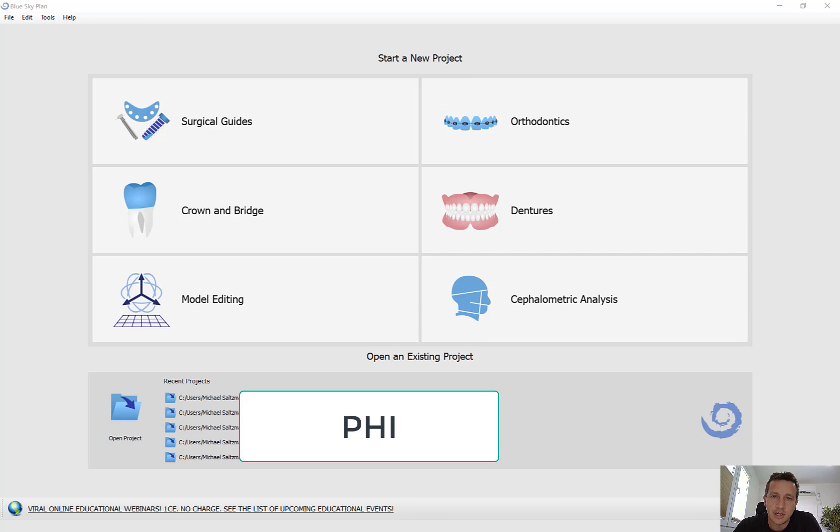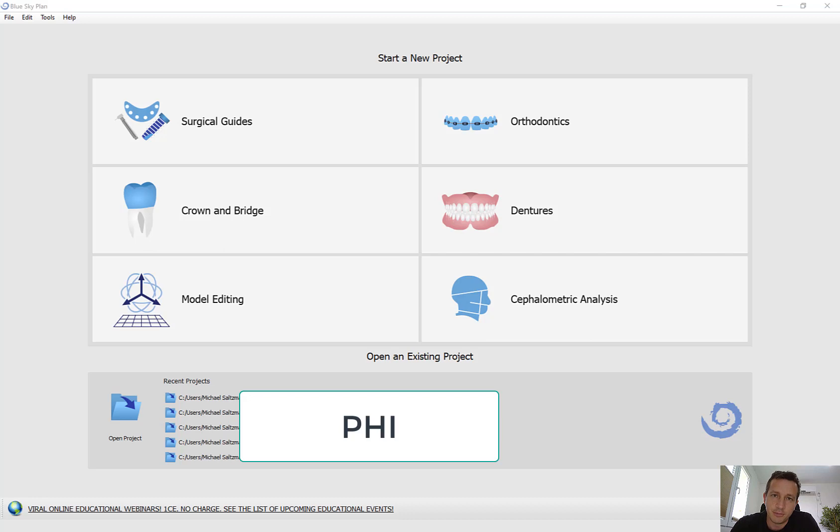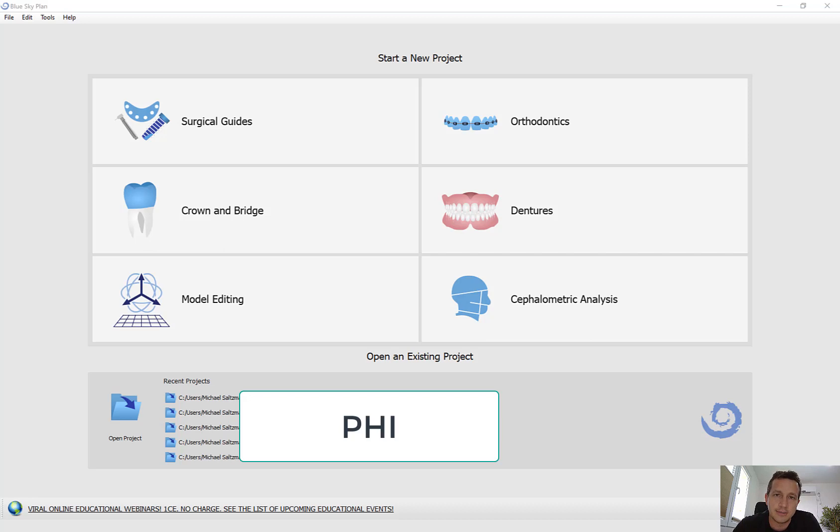The most significant update is that you can now use the software to design the crown and export it to both an STL file and also generate an XML configuration file that can be used for milling the crown in a milling machine. So with this updated BlueSkyPlan, you can design the crown, export it as an STL, and create an XML configuration file to be milled in a milling machine.